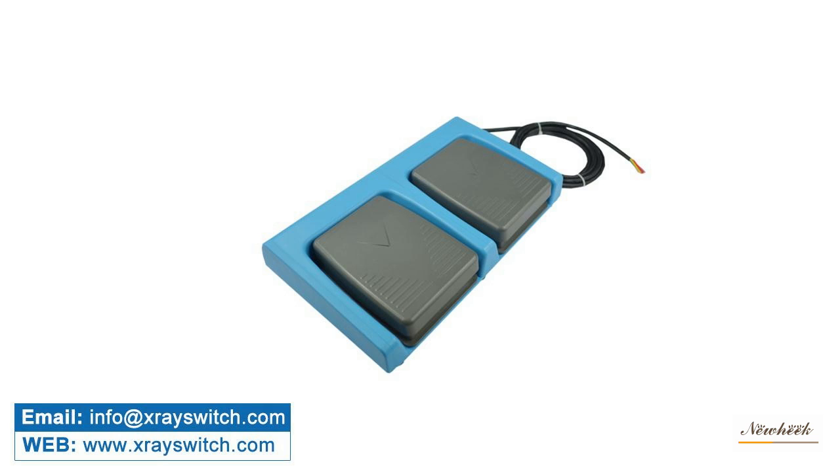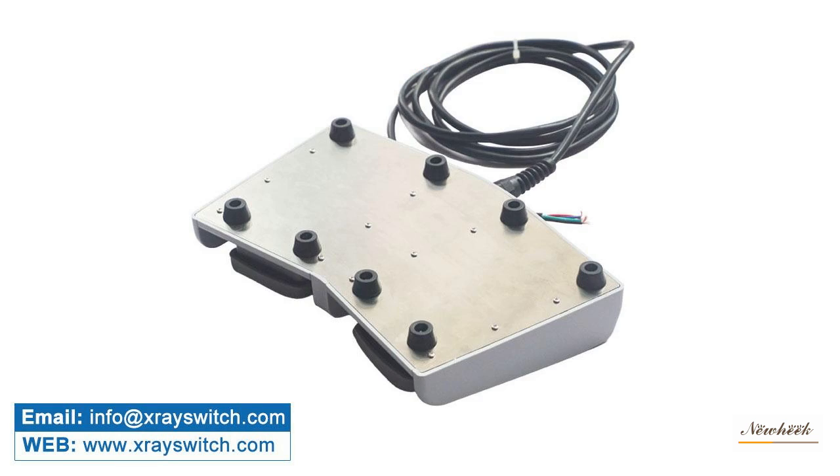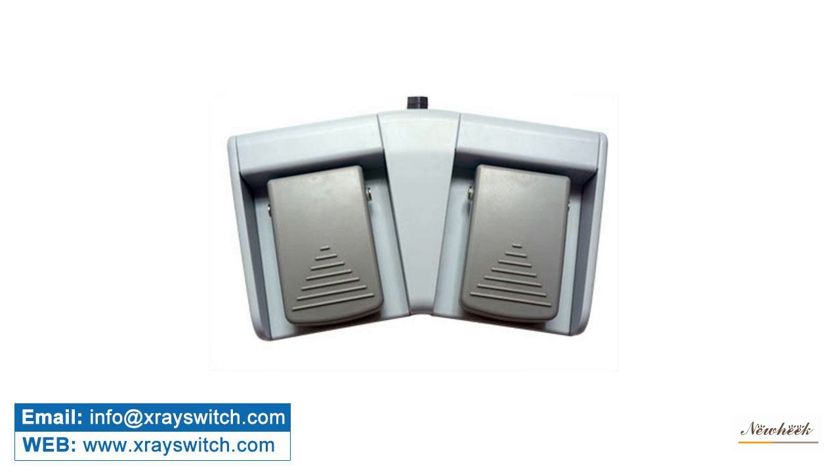New Heek Medical x-ray foot switch is elegant in appearance. With or without a frame, radiant or flat, it can be selected according to the customer's preferences. Our medical x-ray foot switch can also be customized for waterproofing.